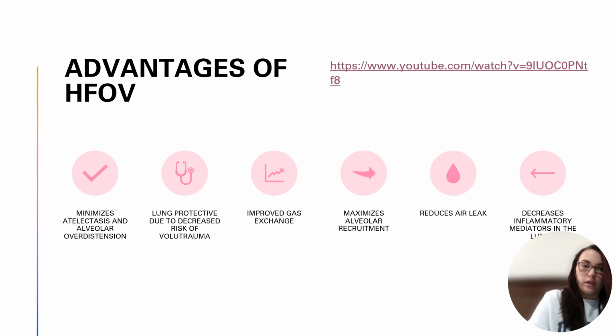I've got this quick video here that I guess you'll have to pull up outside of this video, but it's just basically a 10-second video showing what the lungs look like when you initiate the oscillator. It goes from being atelectatic, not a lot of movement, to slowly building them up, getting that good recruitment, and then the wiggle of the lungs.